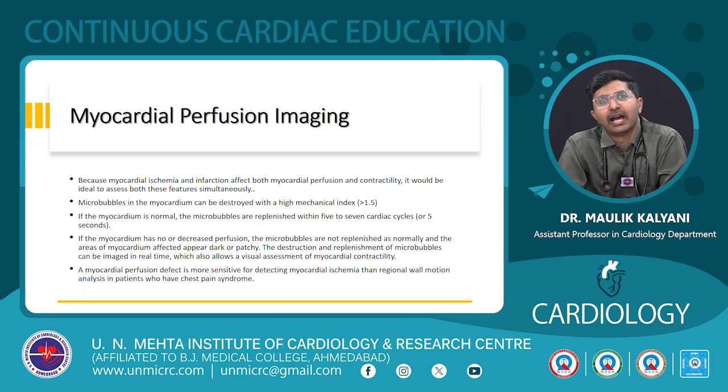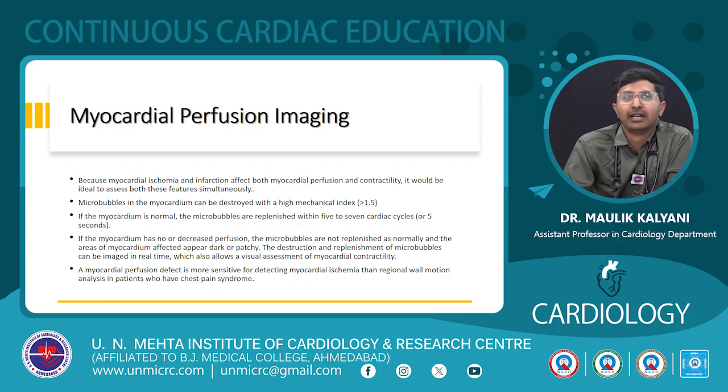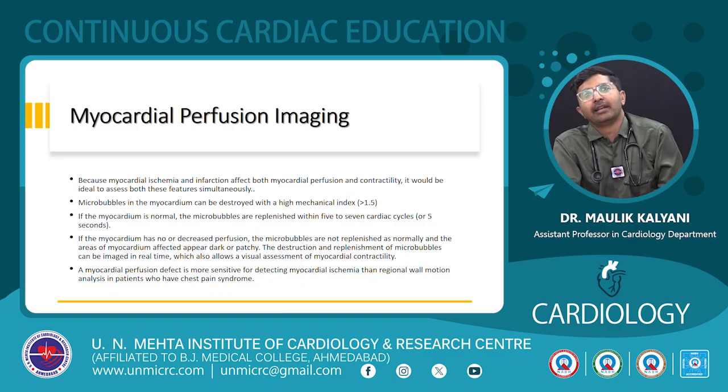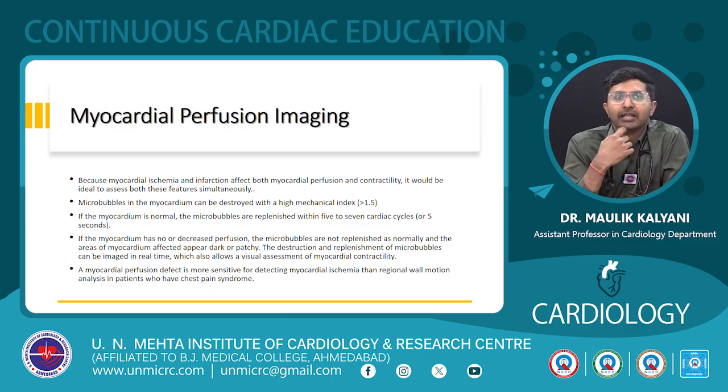As we discussed, a very high mechanical index, more than 1.5, destroys all the microbubbles. So first we inject the contrast, then we produce a very high mechanical index, which destroys all the microbubbles, then we decrease the mechanical index. The myocardium will be reperfused and the microbubbles will be replenished, which depends on the cardiac cycle, around 5 to 7 cardiac cycles.